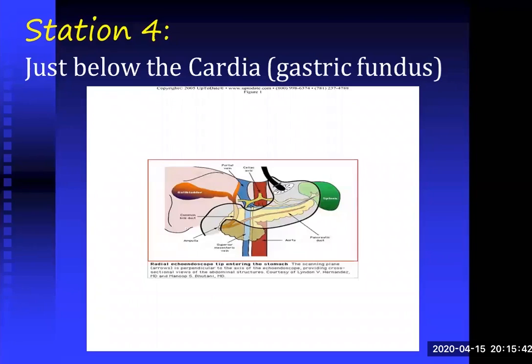But in up to 80% of patients, I can see the whole intra-abdominal structures, including the head of the pancreas, neck, body, and tail, and the whole length of the common bile duct, the whole length of the pancreatic duct, papilla, and of course, the aorta and its branches, and the venous confluence, and also the uncinate process. So I can see all structures from the stomach, including the papilla, in up to 80% of patients.